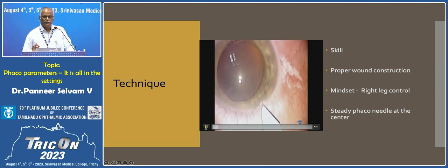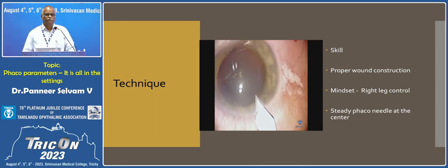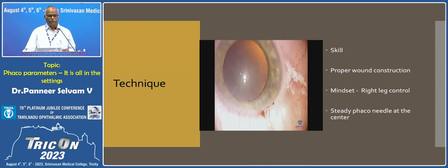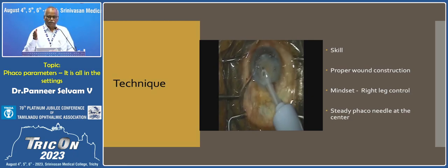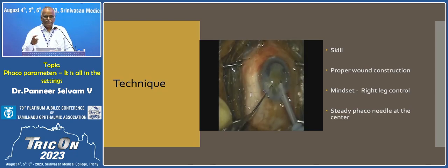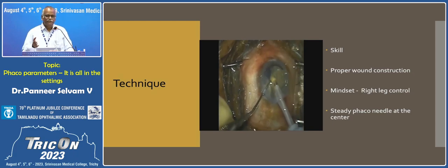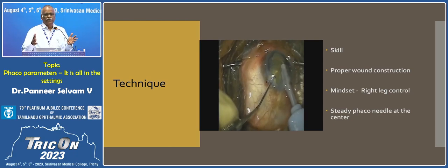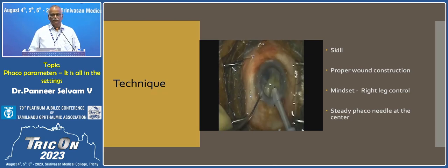So how do you make the incision? If your incision is slightly bigger, there is a leak, and consequently further problems. In phaco, every step properly done helps the next step. If you bungle one step, the next step is much more difficult. And the mindset is, we always think the phaco needle is operating, but it's actually our right leg that is operating. We control the whole thing with the foot pedal. And if you keep the phaco needle at the center most of the time, you are safe.